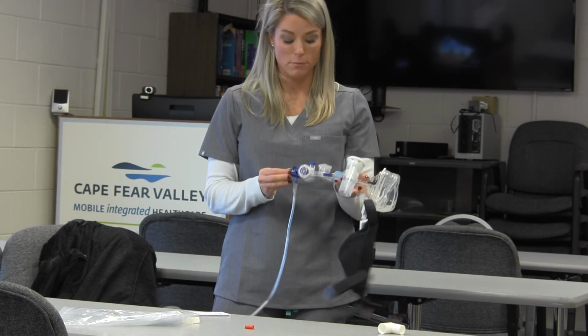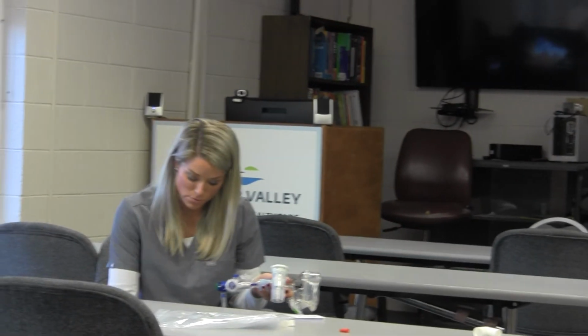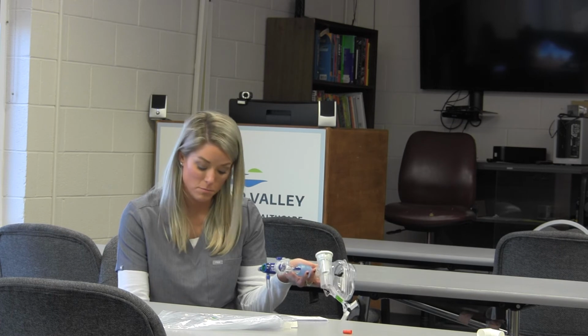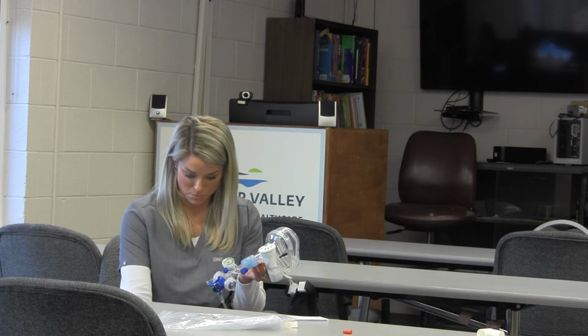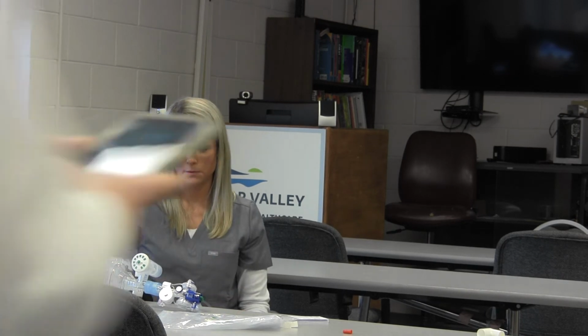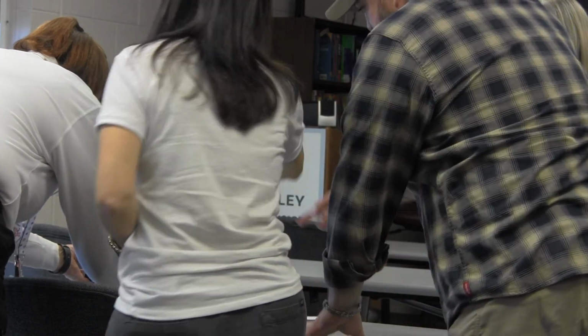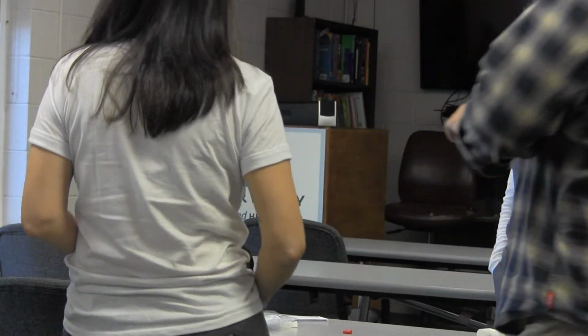So you just want to make sure it's in CPAP mode instead of bi-level. So start with CPAP to give a neb treatment, and then turn on your O2 and put it up to the patient's face that way. But it has to stay in the CPAP mode to give the neb treatment. We should probably take a picture of that. It's oxygen for the neb, yes. Yeah. Two tanks.